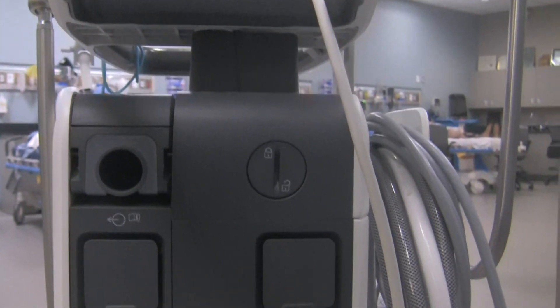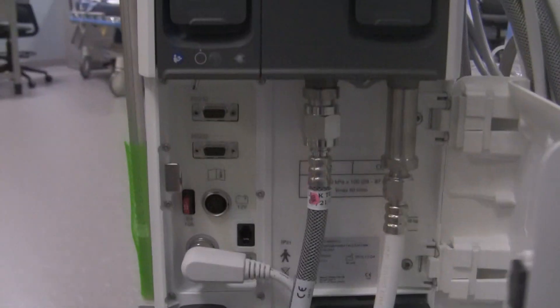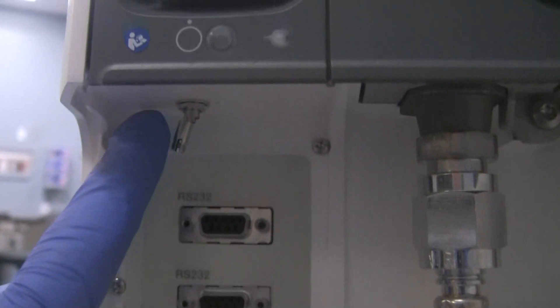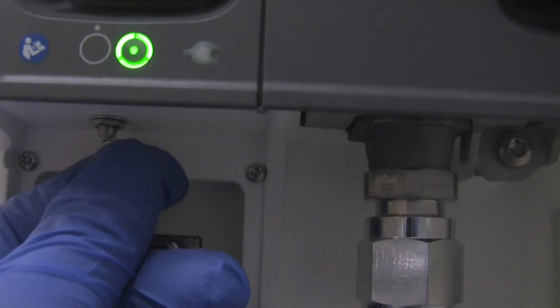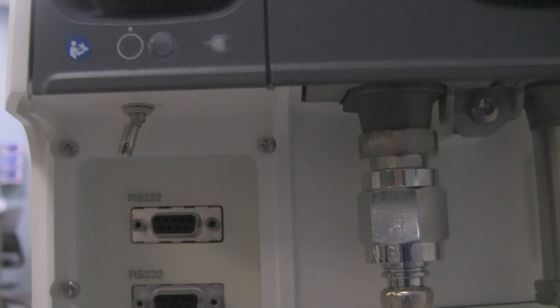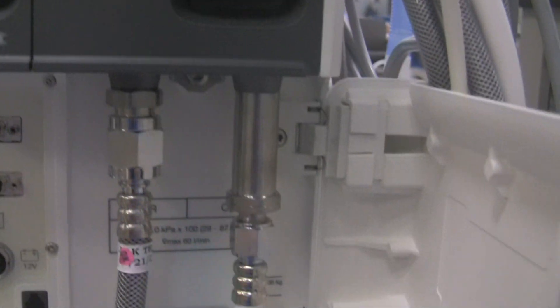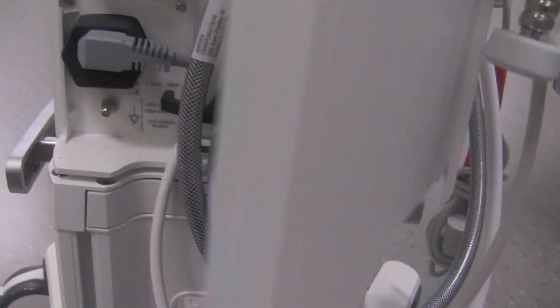Now, with the Servo I, the on/off switch is at the back of the ventilator. This ventilator does not have an on/off switch on the display — the on/off switch is actually behind this door. So if you just open the door and pop it open like so, and go way to the top of the door inside here, there's your on/off switch right there. To turn the ventilator on, you have to pull down on this and then switch it over to the right — that turns the unit on. Likewise, to turn it off, pull down and flip it to the left. It has some other ports for inputs or outputs. This is also where the high-pressure gas hoses connect, and where the power cords attach for the unit to go to your electrical outlet. When you close the door, just make sure the hoses line up in there and then it's easier to close the door properly — nice and closed.